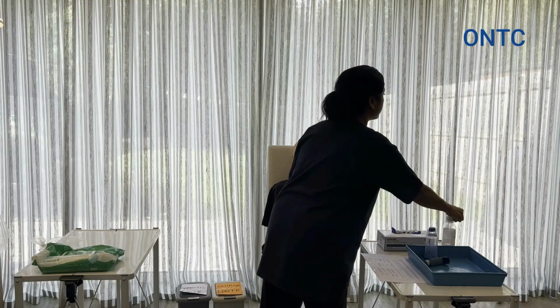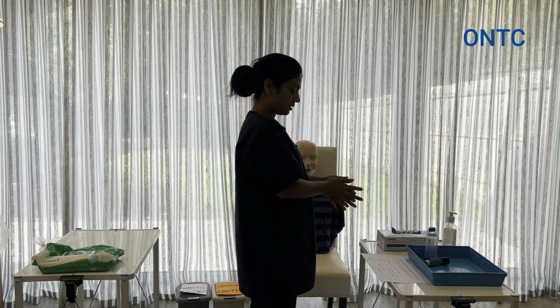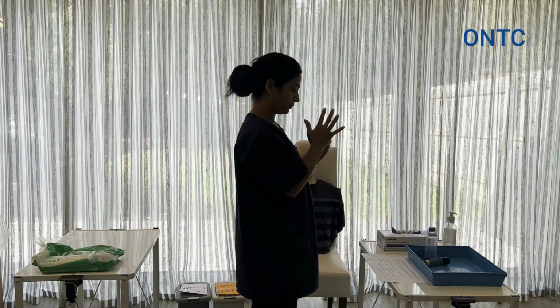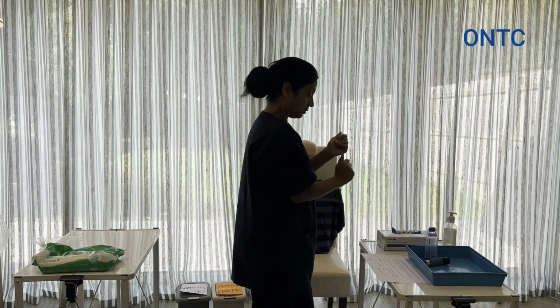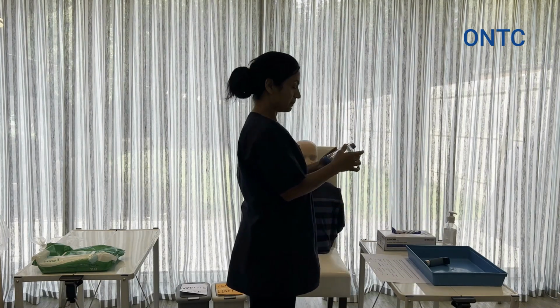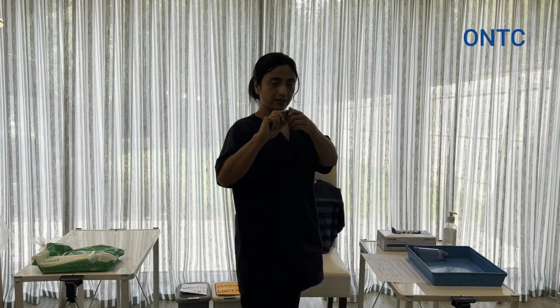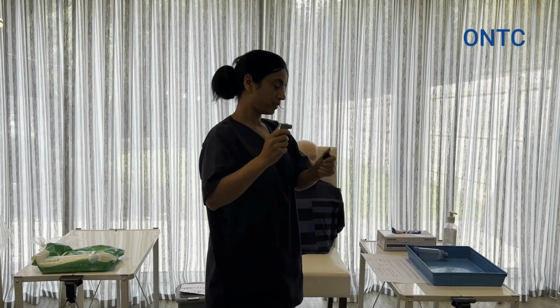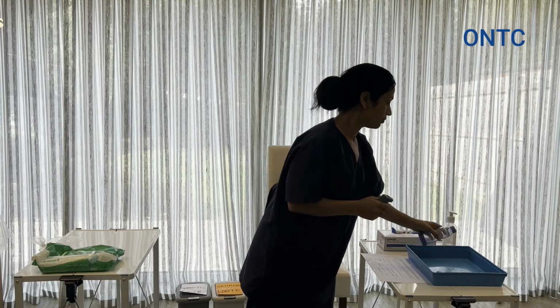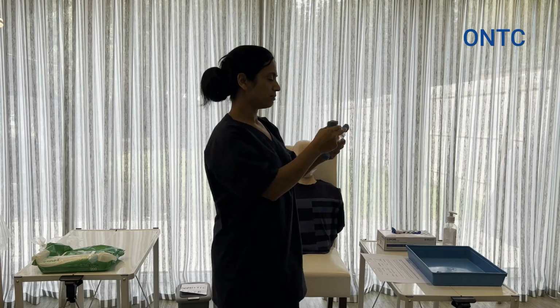I'm going to clean my hands again before we start giving it to you. Okay, Lawrence, like I said, I will not be asking you to hold the breath. We're going to use a multiple breath technique. So I'm going to do it. I'm just going to take the cap off the inhaler here and put that in. I'm going to take the mouthpiece off for you to take in your mouth later on.